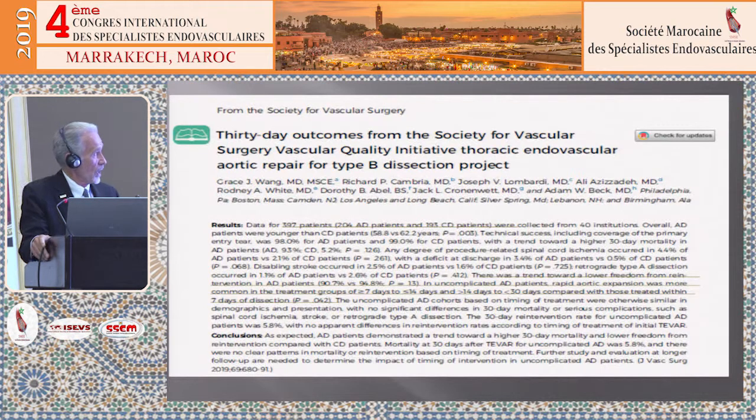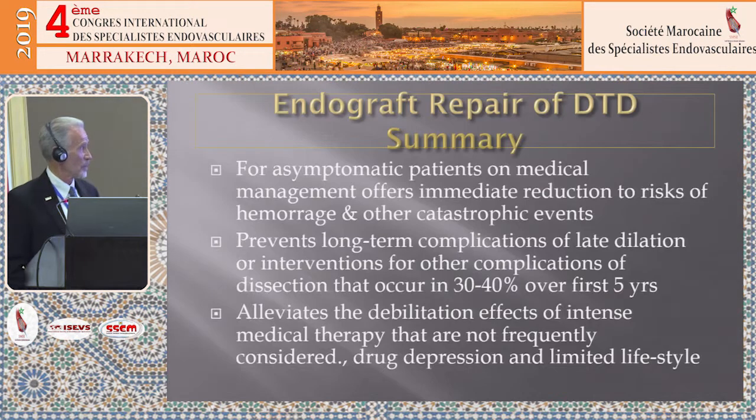This is a 30-day follow-up from the SVS that had a group looking at this indication, and when you look at it, there's a lower freedom from adverse events early on. And in this particular publication, it looked like treating the patients at 7 days or less had a higher regression rate, and in the underlying part there, can't quite see it with the pointer, but further out there was less regression. But again, maybe Alan will show you some of the images that he's got related to MR and classification of how that dissection flap mobility is going to impact the treatment.